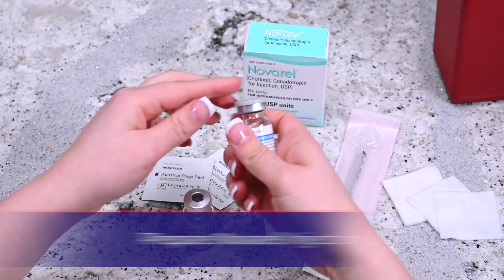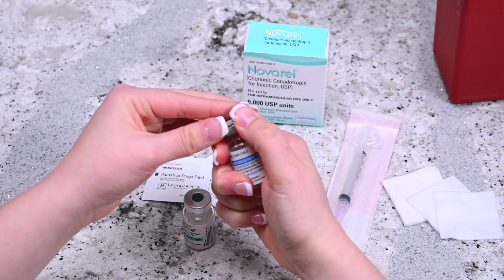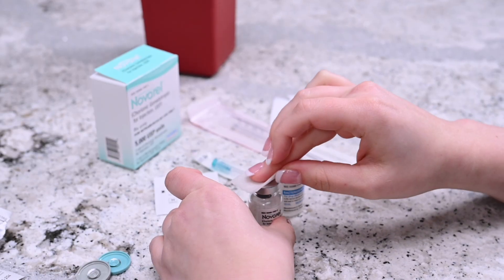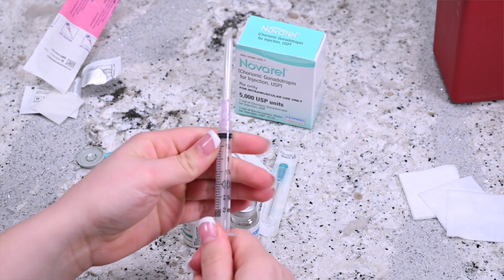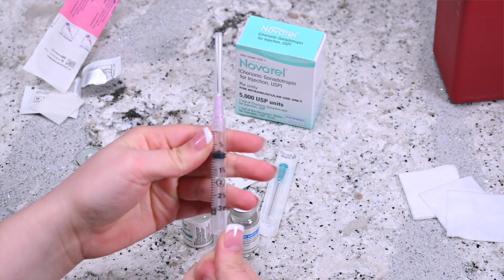Remove the cap from both vials and disinfect the top of the vials with the alcohol pad wipe. Hold the syringe upright and draw in the same amount of air as the dosage required.